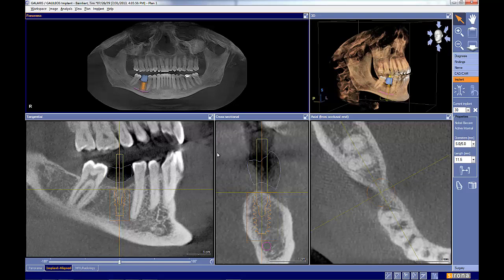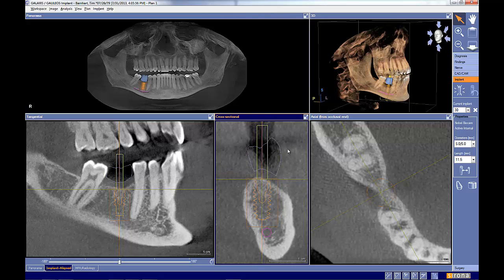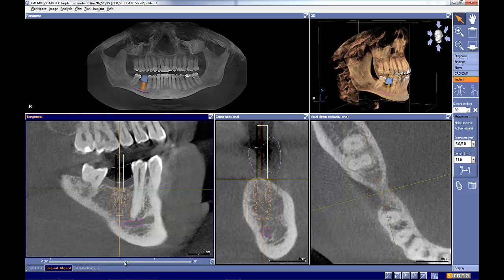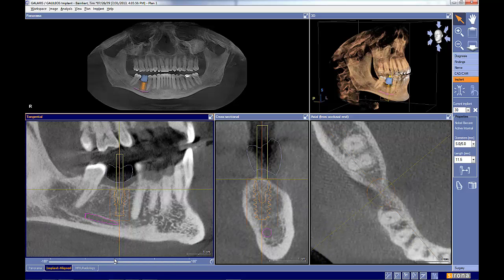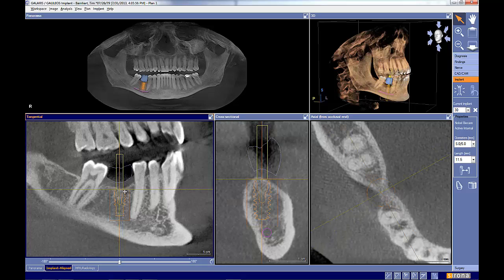So now when we come to the implant line view, we can clearly see our nerve here. These little things are maybe overkill, but just in the very beginning, I prefer to have this data there. So now let's get to the question at hand. The first thing I look at is buccolingually. We're not perfectly centered, but it's not about being perfectly centered. It's about being properly in the bone, having adequate bone position around it. And in this particular case, we do.